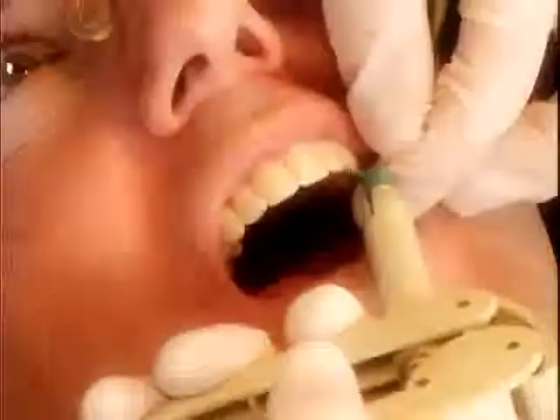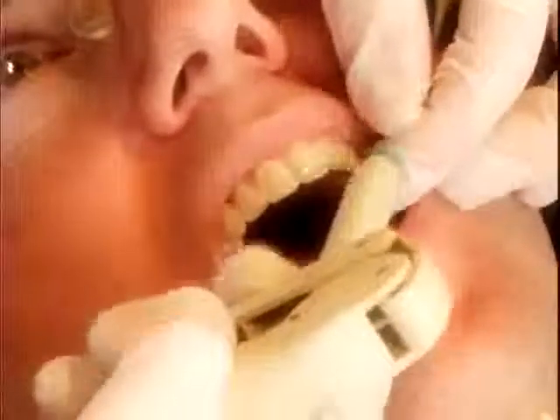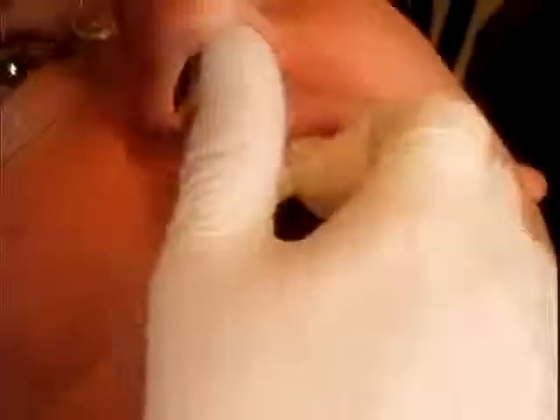At this point, I'll be doing a little bit of finessing in Randy's smile to see what I would appreciate in terms of length and character overall. Historically, cosmetic dentists have used computer simulations to show patients interested in cosmetics what their smile could look like. The difference between that approach and my approach, which is this truly fitted cosmetic simulation, is that I can actually build a smile complementary to facial form and arch forms. It also gives Randy as a patient the opportunity to look in a mirror and smile at himself. An impossible feat with a computer.